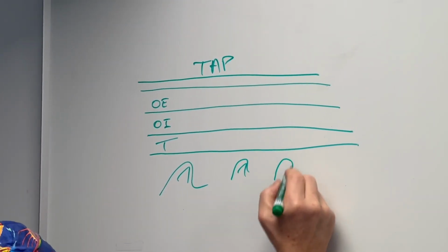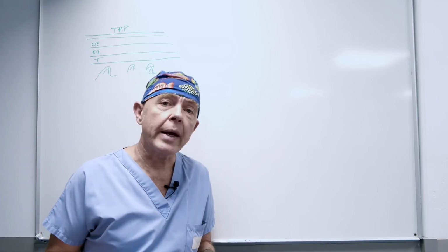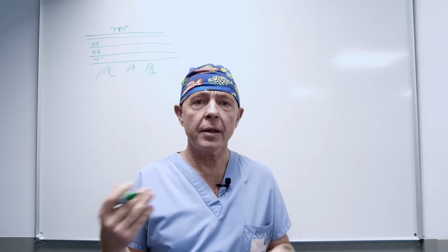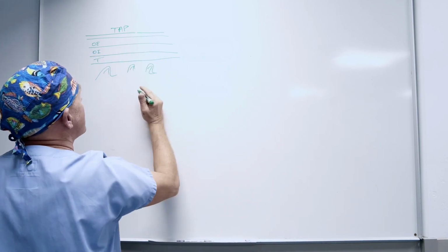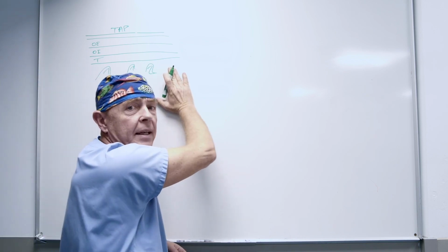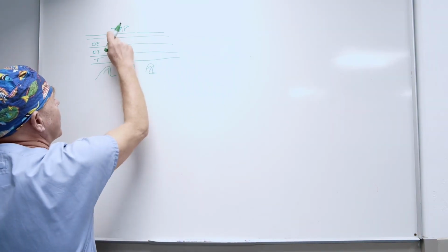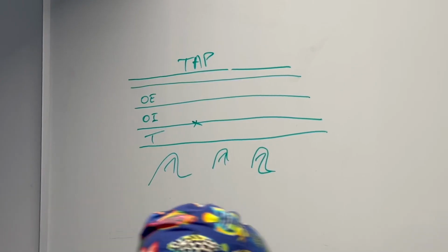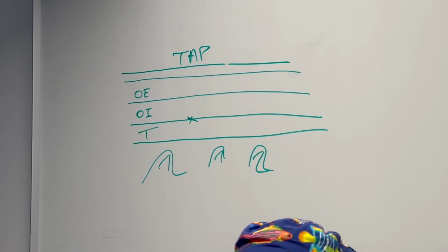Mobile formations, which are essentially the loops of the intestines, all right? So what I recommend to you is that in diffusion blocks, you should aim for the second to last structure. This means instead of counting 1, 2, 3, begin counting from here. You know it's the peritoneal cavity, so count in reverse like 3, 2, 1, and you will understand that the target space will be at the second to last structure. This is something we will always find a little bit in the different diffusion blocks.